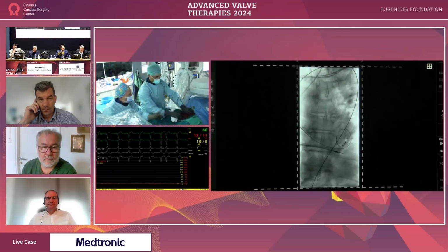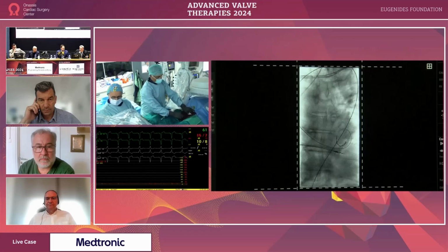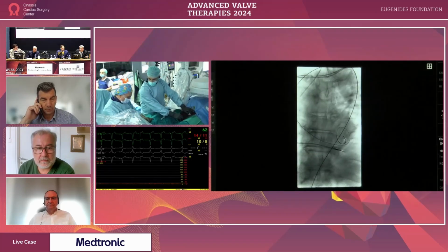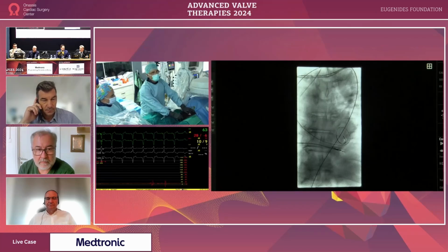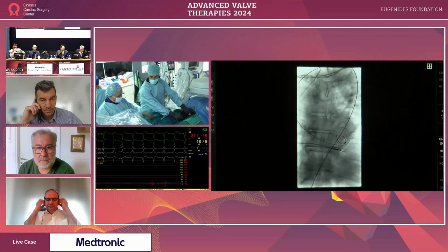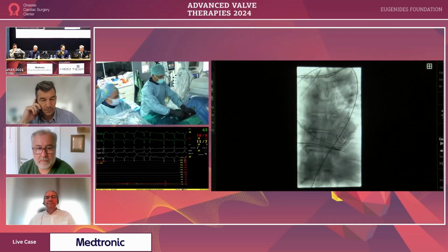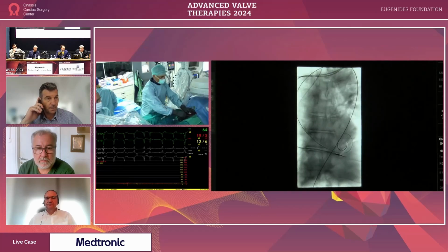For the predilation issue, there are also some important points. If a patient had a bicuspid aorta, we must do predilation. And if a patient had a horizontal aorta, we must also do predilation to change the angle. I always look at the hockey puck views.